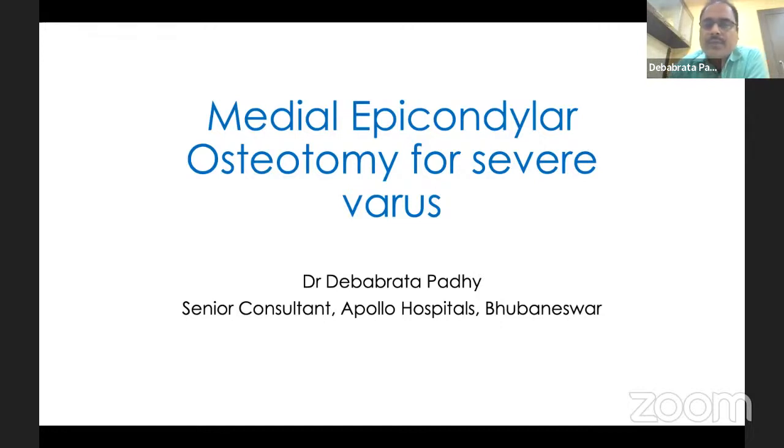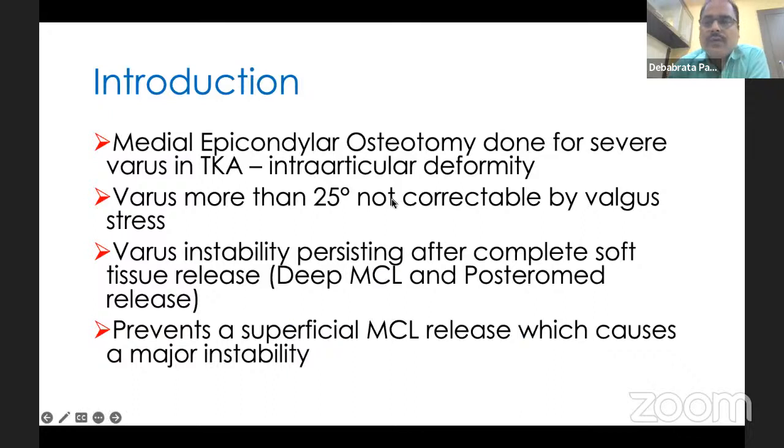It will be a very short topic with video to discuss some major points on when and how we should do a medial epicondylar osteotomy. As we know, a medial epicondylar osteotomy is done for severe varus, mostly intra-articular deformities, which are more than 25 degrees, mostly not correctable by valgus stress after anesthesia.